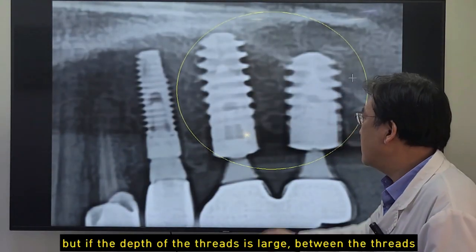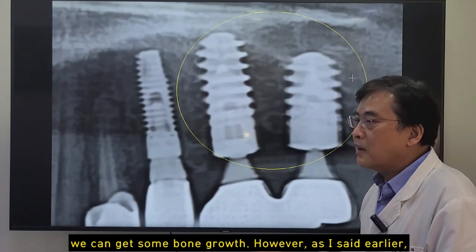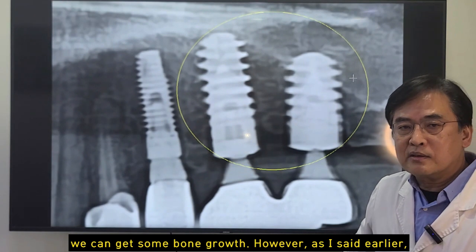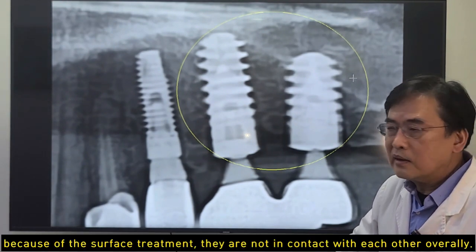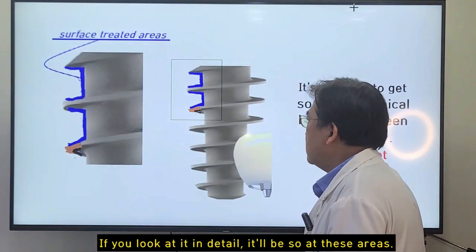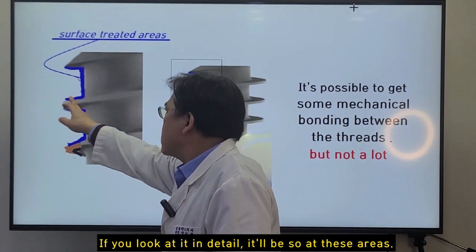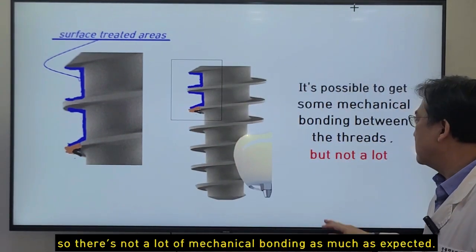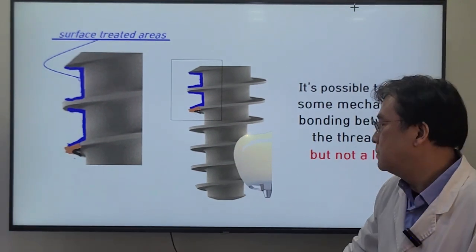But if the depth of thread is large, we can get some bone growth between the threads. However, as I said earlier, because of surface treatment, they are not in contact with each other overall. If you look in detail, it will be so in these areas. So there is not as much mechanical bonding as expected.